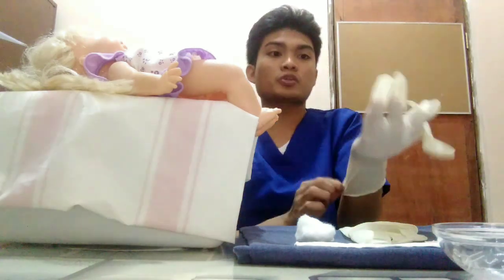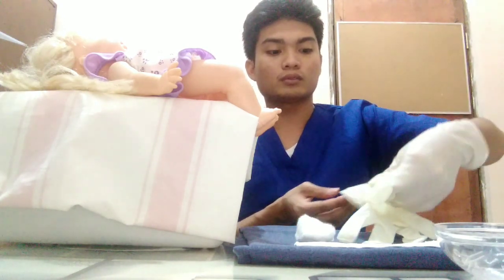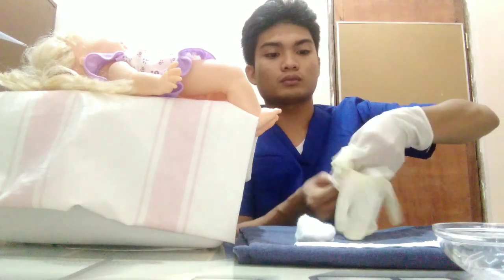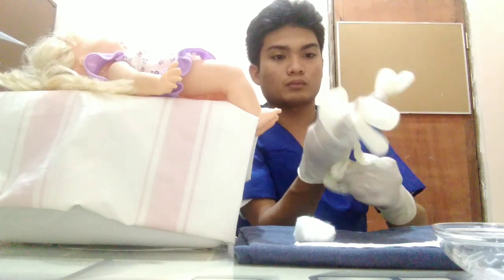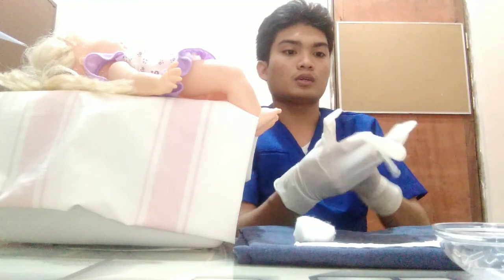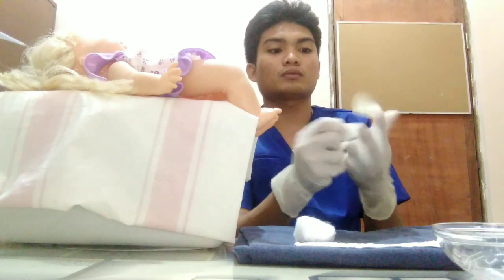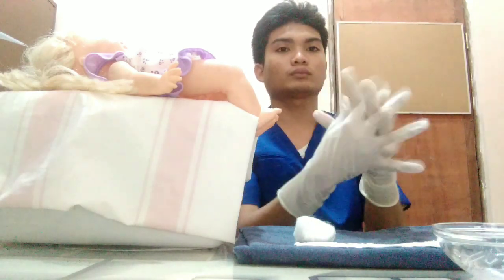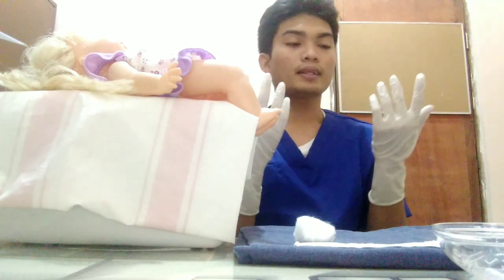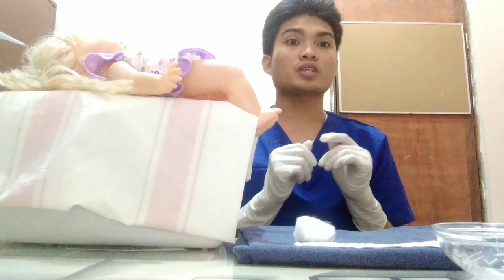So it's okay kung hindi siya masyadong maayos. We will be fixing it after we put the next glove. Okay, now we will be fixing it. Now that we've already put the sterile gloves, we will now be positioning the patient.